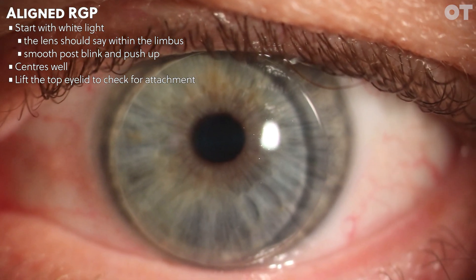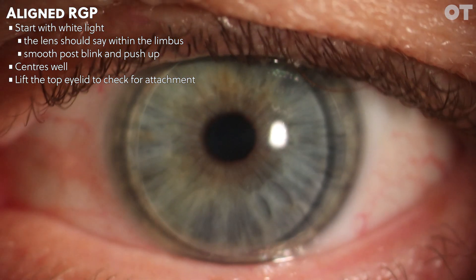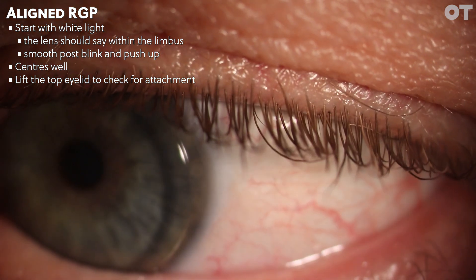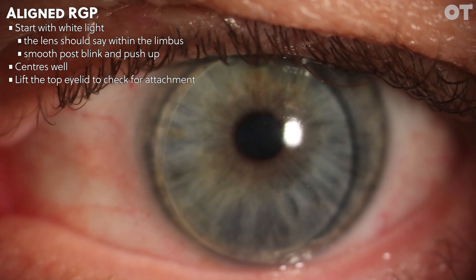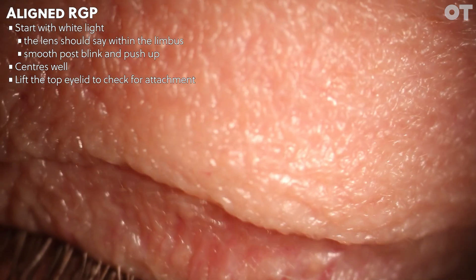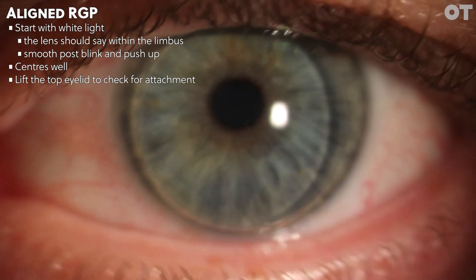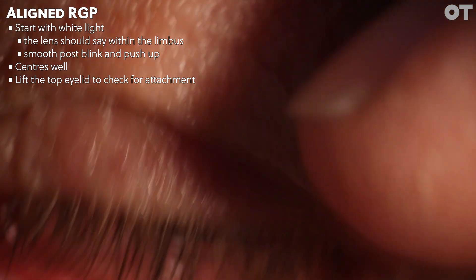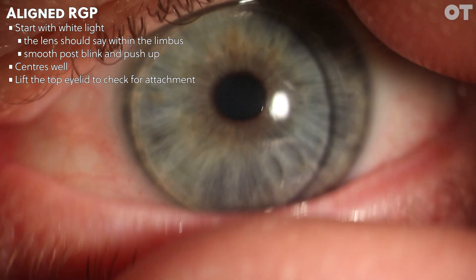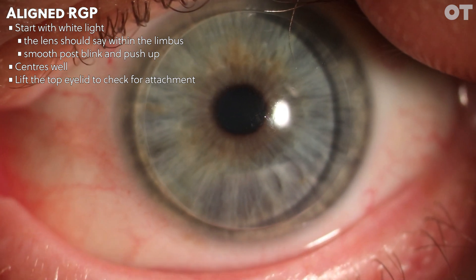Let's start off with an optimally fitted RGP lens, otherwise known as an aligned RGP contact lens. It's good to start off the assessment using white light to look at the movement post-blink. In this example, the lens stays within the limbus in all directions of gaze and has a nice smooth movement post-blink. The lens shows a smooth recovery on push-up and it's centred well.